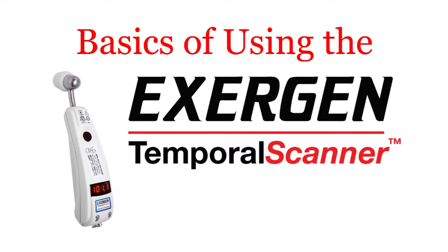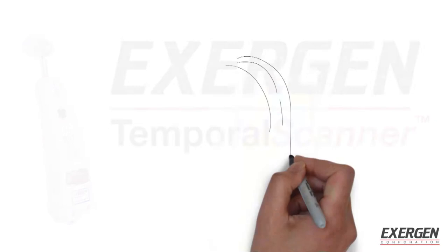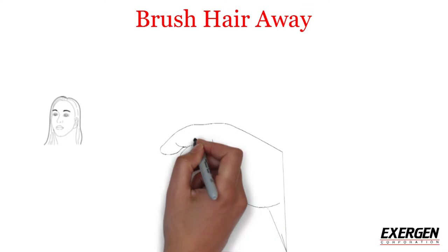These are the basics of using the Exergen Temporal Scanner thermometer in order to get the best reading. Please use the following directions: brush any hair away from the forehead and ear, and place the scanner probe flush on the forehead.